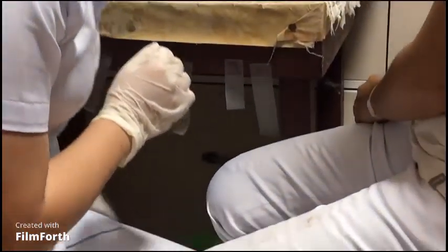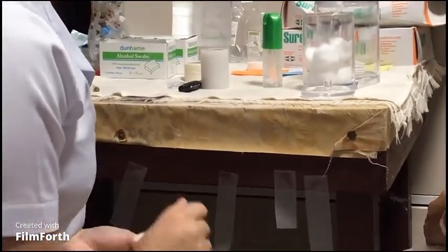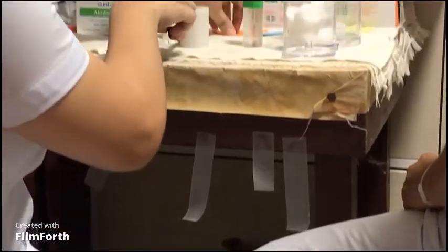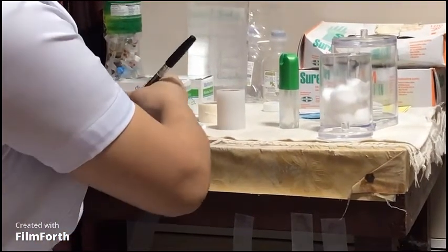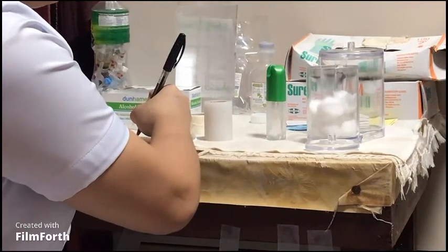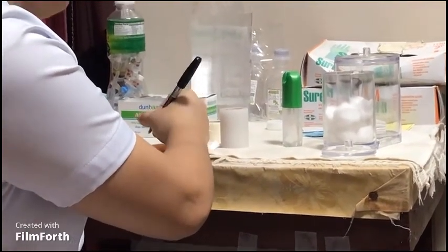And then remove gloves. Wash hands, and document all relevant information. Include the time of administration, drug name, dose, site, and the client's reaction. Assess the effectiveness of the medication at the time it is expected to act.